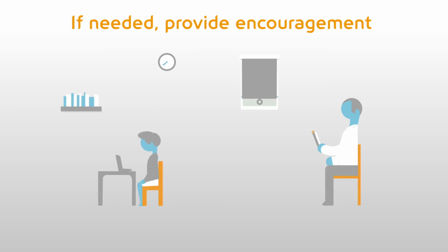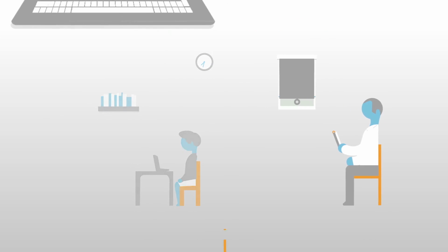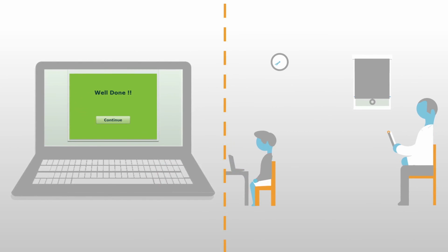If the patient begins to show signs of extreme impatience, such as staring into space, talking continuously, or asking how much time remains, prompt him/her to complete the test. Remember that encouragement should focus on helping the patient finish the test, not on improving performance. When the test is finished, you will be notified that it has been successfully completed.